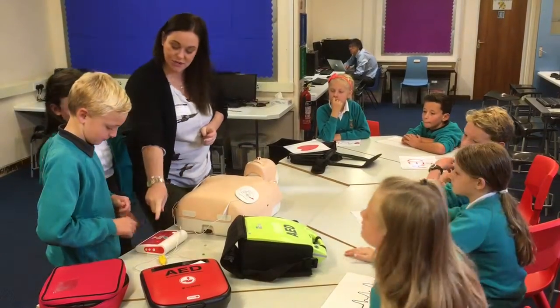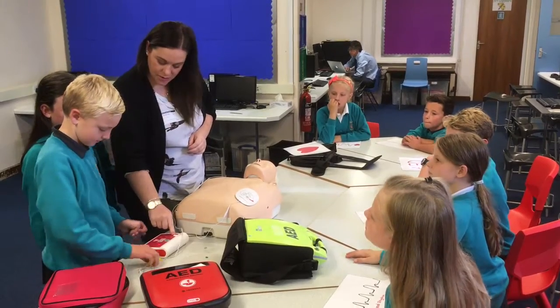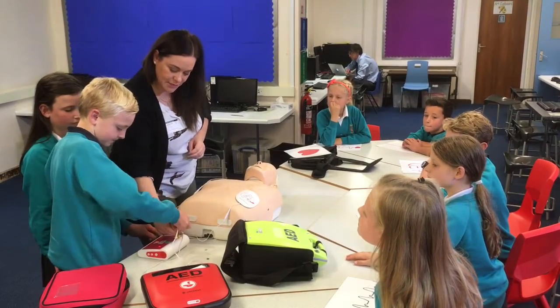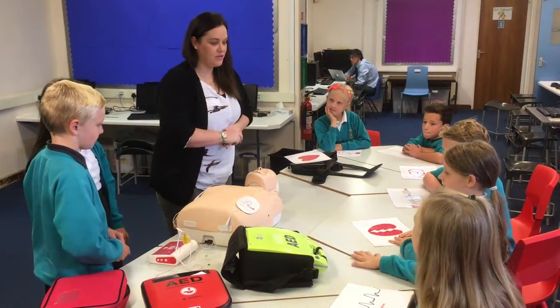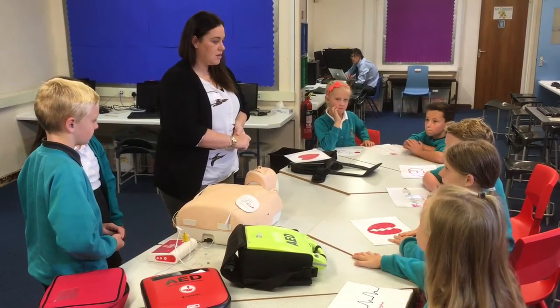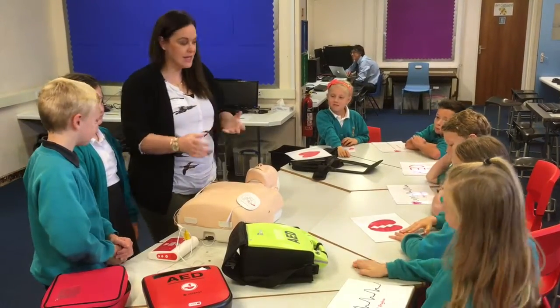Now you need to plug it in if it's not already. Yours is already ready to go plugged in. Just in there - that's it, other way. That's it. And the machine will then take the rhythm of the heart. And what rhythm do you think it's going to find? Do not touch the patient. A bad rhythm.